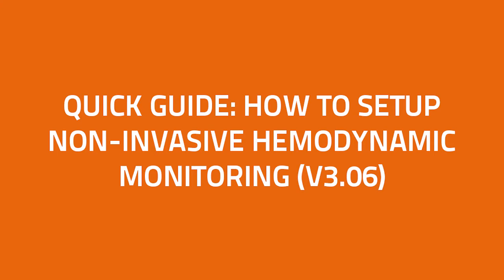Hi and welcome to the LIDCO clinical education video series. In this short video we'll go through how to set up a non-invasive LIDCO system to obtain continuous arterial waveform and hemodynamic values from the fingers.